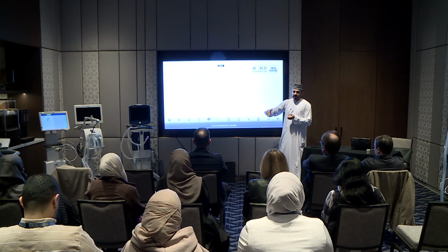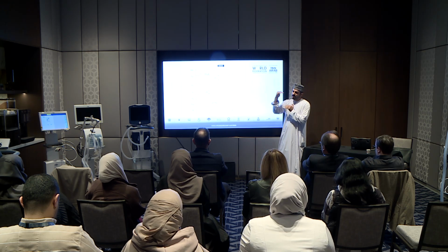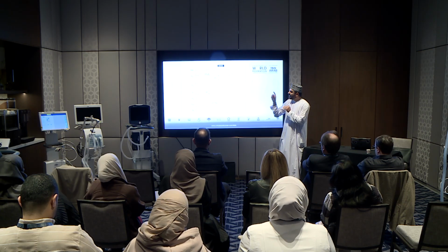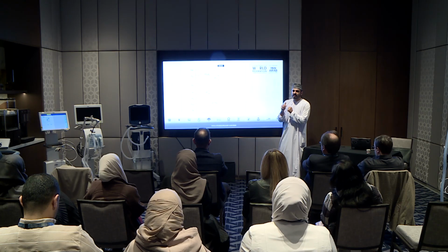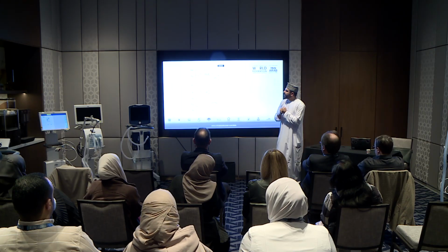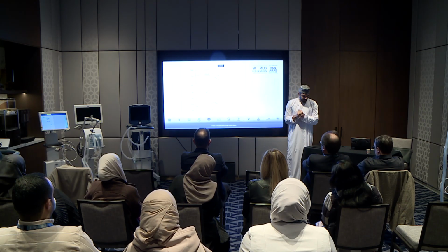That drop in the pressure, adding to it the PEEP the patient had, tells you the total pressure that the patient used to suck in, in order to drop. And this is a reflection of the respiratory effort, not the respiratory drive, because you can see here that the Pmus is correlated with the drop in the Pocc.